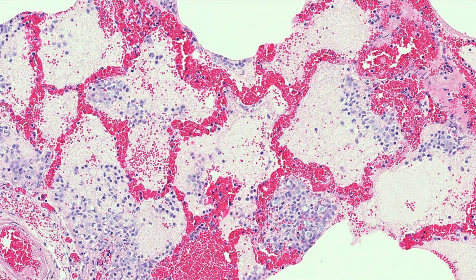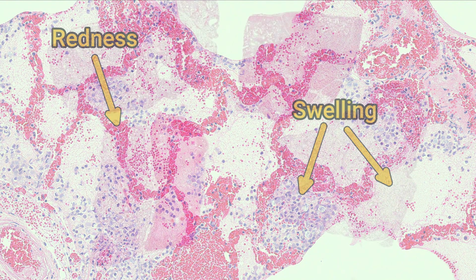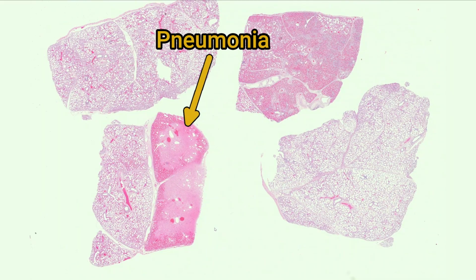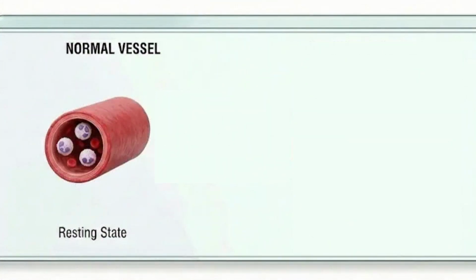The redness component might manifest as congestion or hyperemia, while we can see the causes of swelling, such as leakiness of blood vessels signaled by edema, fibrin, and leukocyte infiltration. We're going to focus on a slide of acute bacterial pneumonia in a calf, with some references to normal tissue sections. The first stages of inflammation affect the blood vessels.